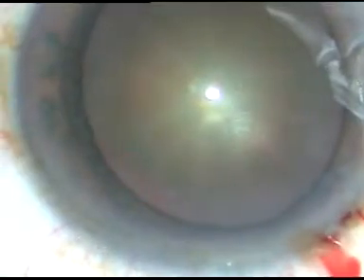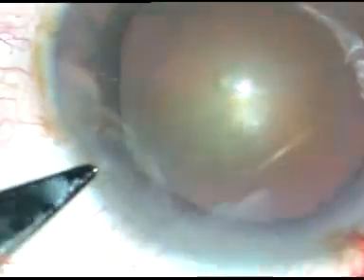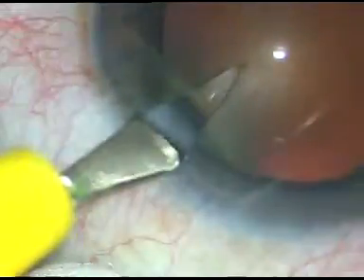Dear colleagues, this is a very nice case for beginners. This is phacoemulsification of a cataract with grade 3 nuclear sclerosis. By this time, all the incisions have been made.